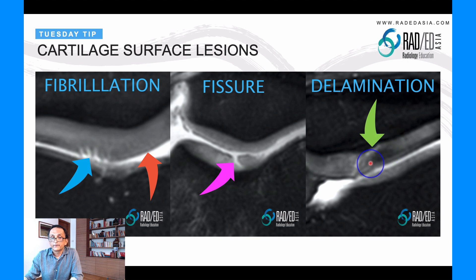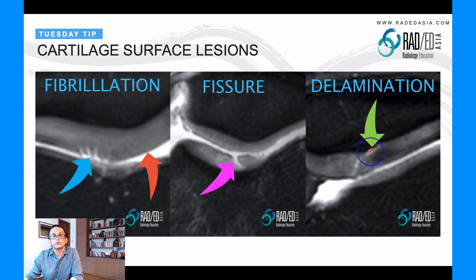What can happen is that the fissure can get down to the cortex, and then it can start to undermine the cartilage. When it undermines cartilage like this, this is called delamination. Delamination is a separation of cartilage from the cortex, and this bit of cartilage is now weakened.